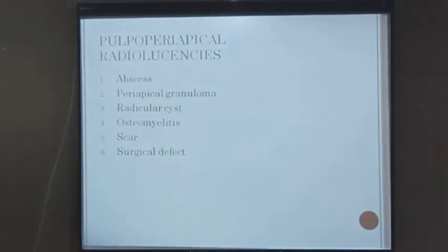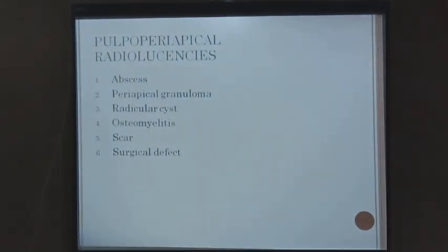So just because you don't see a periapical radiolucency, you cannot say it is not an abscess. You palpate the patient in the periapical area, the patient says pain, that is abscess. If you don't see a swelling also, it is okay. You palpate that area, you see the patient elicits pain, you call it abscess. Radiographically, if you see periodontal ligament space widening, again it is called an abscess. Differentiating between abscess and granuloma.